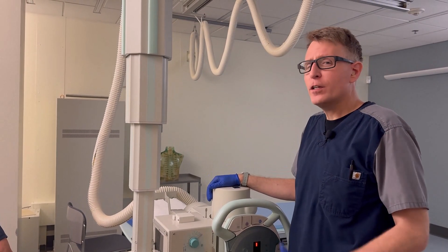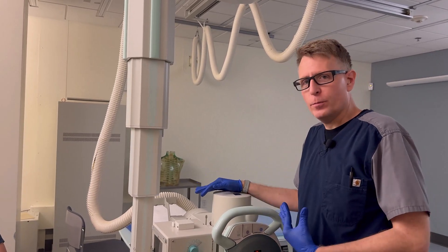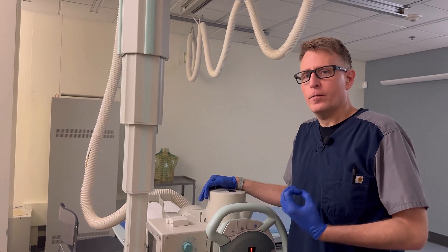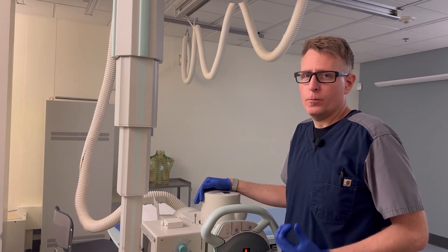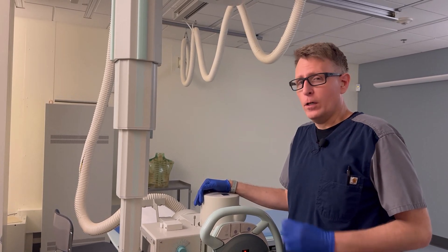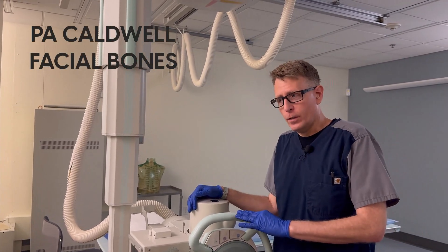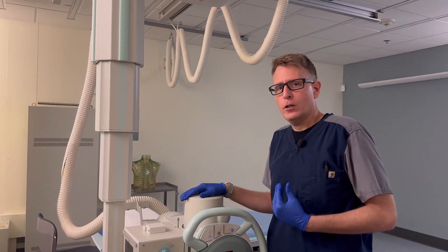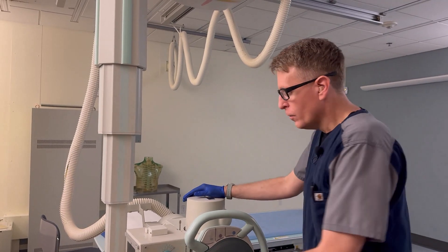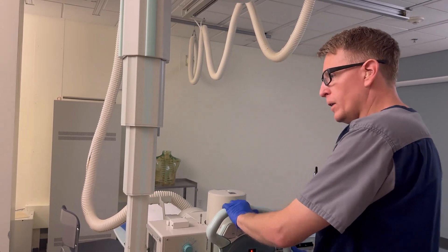For facial bones, very similar to a sinus series. In fact, we're not going to show you separate facial bone projections of the PA Waters and the lateral because they're pretty much identical to what you would do for sinuses. We are making a distinction for the PA Caldwell for this facial bone series — to do that the traditional way with a 15-degree caudal angle, versus sinuses where you never want to angle, to show the fluid levels.